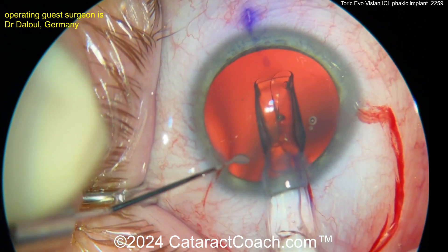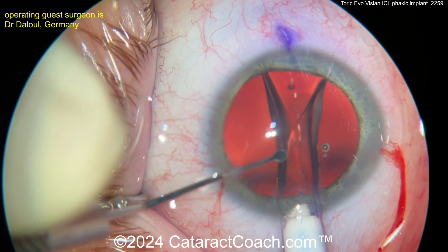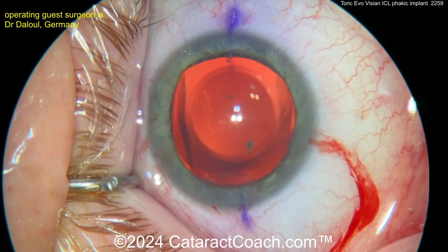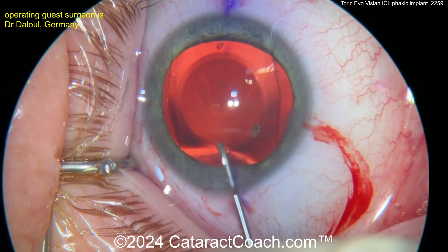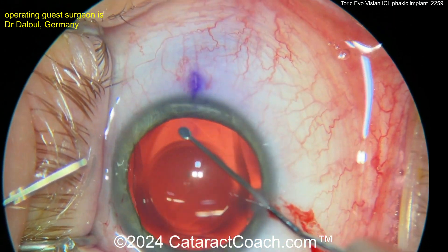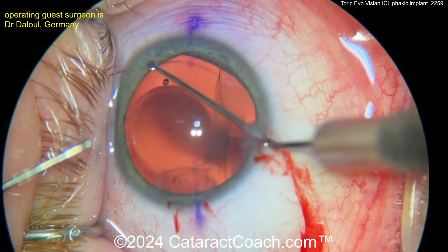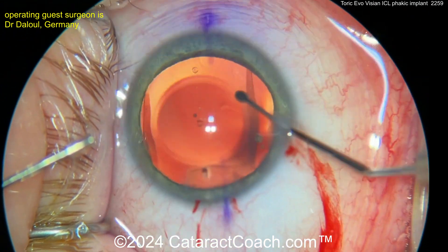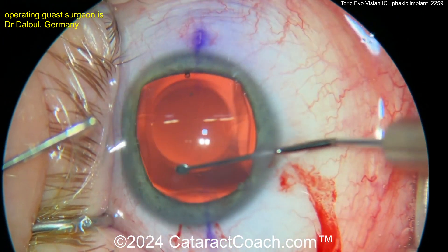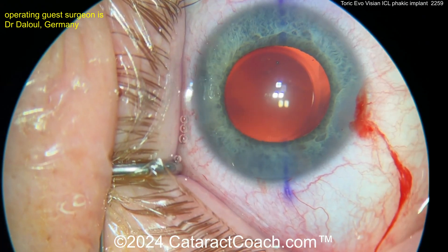This is going in nice and easy — you can see it's folded up appropriately as it unfolds. You can even get those four tabs in under the iris right off the bat. The surgeon is placing it very nicely. Add a little more viscoelastic to make sure you have plenty of room, then get all four of those corners tucked in using the instrument, one at a time. There's one, and there are a couple more. You'll also find a video from me about 15 or 18 years ago on YouTube showing how to place the ICL with just the injector — no other manipulation needed. So obviously more techniques are available.